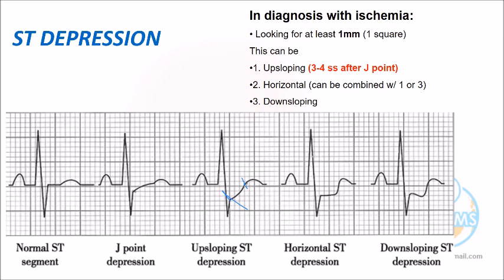No problem. The abnormal ST, you understood that this one, the horizontal depression, down sloping depression, there is no doubt, this is abnormal ST depression representing usually ischemia. But I'm talking about the upsloping ST segment.